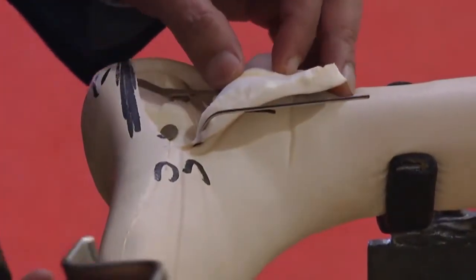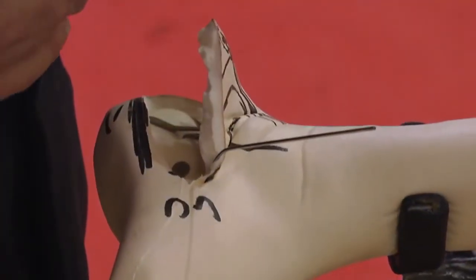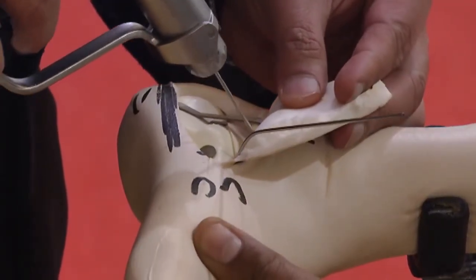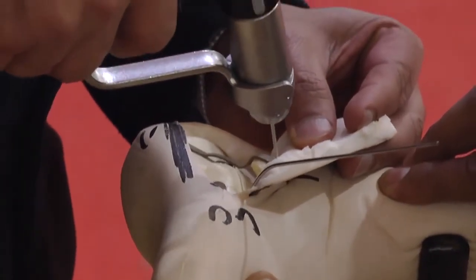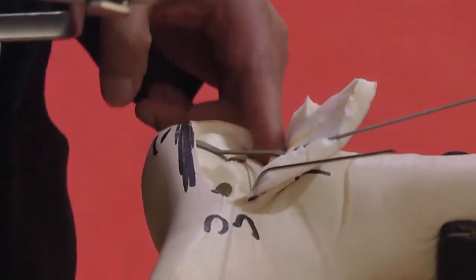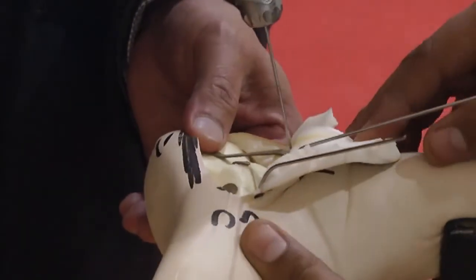Then we put a second K wire, which goes anterior to the neck of the talus. Obviously you do not expose it. Here the bone is seen, but you have not exposed anything in this area, so it is just by feeling the fibula, sliding just anterior to the fibula, and you put this second K wire and then bend it with the drill itself. We are not going to put a third wire, but if you want, you can put a third wire into the posterior tip of the fibula, or maybe into the back of the talus, just posterior to the fibula.